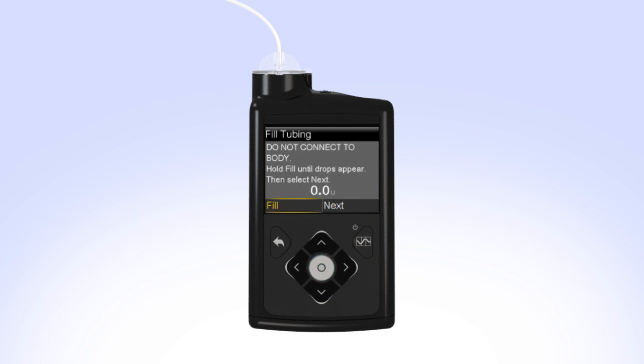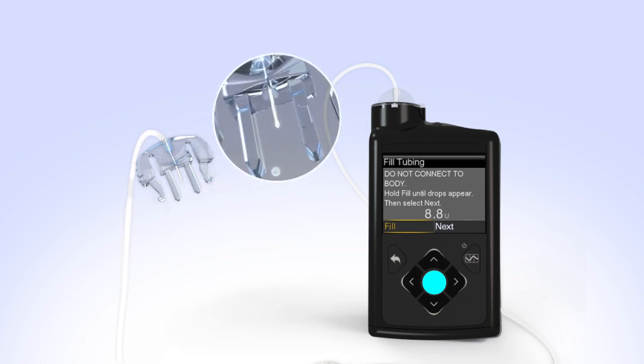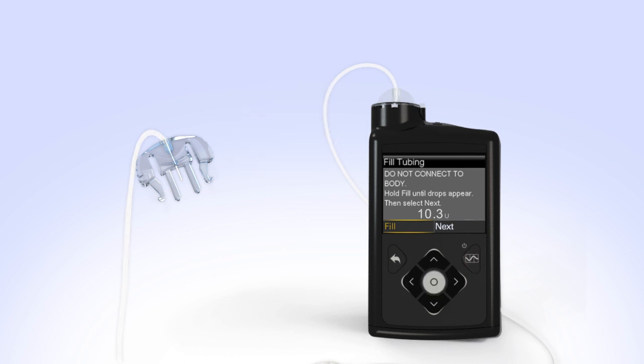You will now fill the empty tubing with insulin. Remove the cap from the infusion set and hold the set so that the needle is pointing down. With Fill highlighted on the screen, press and hold Select. The pump screen will display the amount of insulin being moved through the tubing. Continue to hold Select until you see insulin drops coming out at the end of the needle. If you release Select too early, press and hold Select again until you see drops. After you see the drops, release the Select button. Hold the tubing to the light to check for air. If you see air, press and hold Select again until the air exits the end of the tubing. Then press right and select Next. You have successfully filled the reservoir and infusion set tubing. If you notice anything unusual such as insulin continuing to drip or squirt from the end of the tubing, do not insert it — start over with a new reservoir and infusion set.